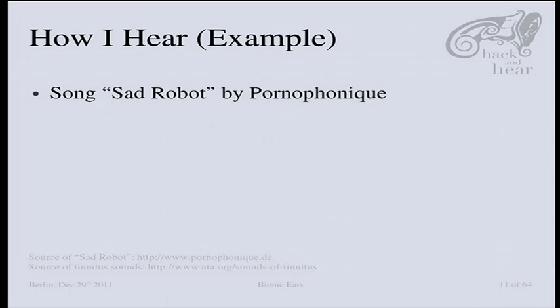So this is not a feedback loop, it's the tinnitus, and without the high frequencies, this is how it is. So it's really hard to actually hear the high frequencies. Yeah, so this is just an impression of what hearing aids have to work with.